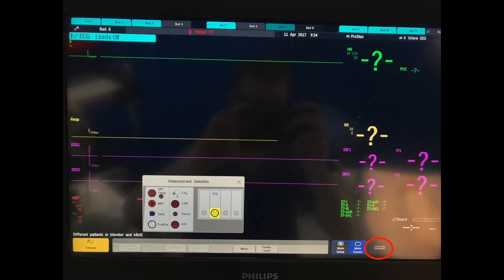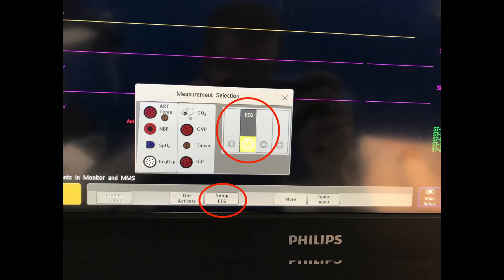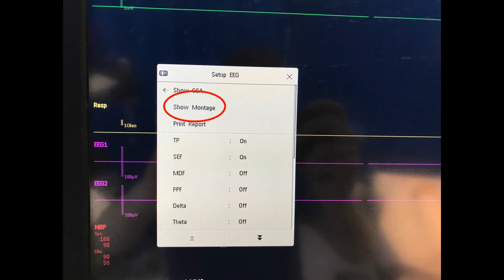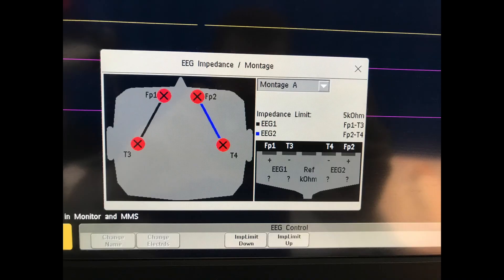Next, touch the icon in the bottom right-hand corner of the screen to open the measurement selection. Click on the EEG module and then select 'Set up EEG'. This brings the setup EEG menu, where you want to select 'Show montage'. This brings the montage up on screen — very useful to confirm you've put the electrodes in the correct place. By default, montage A is selected. If you need to change it for any reason you can do so from the pull-down menu, but for most patients, leave it on montage A.